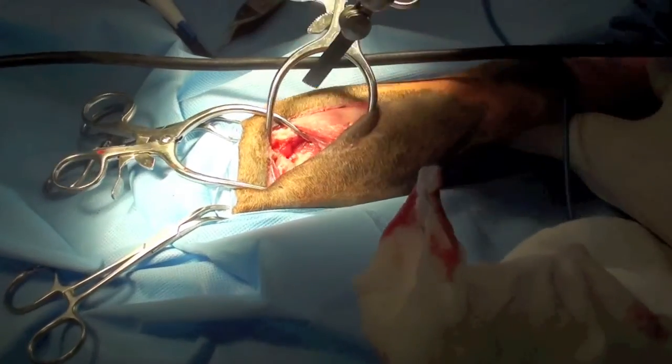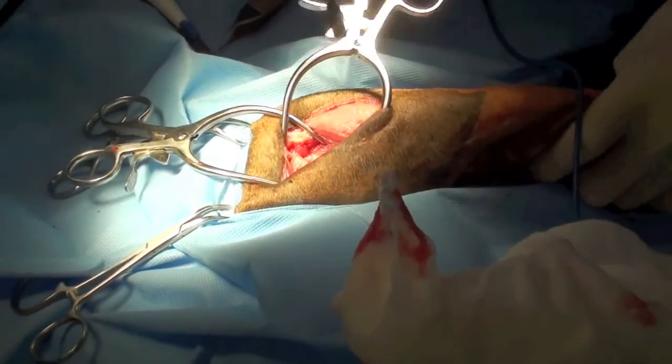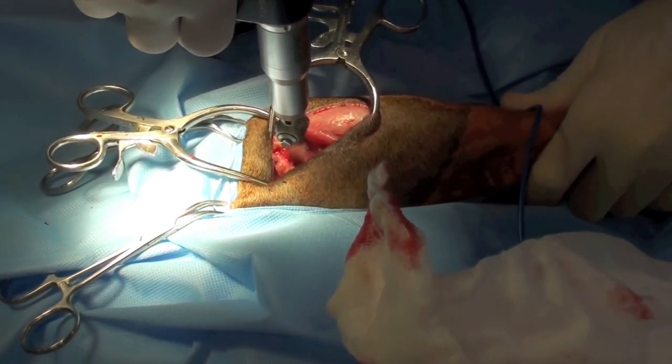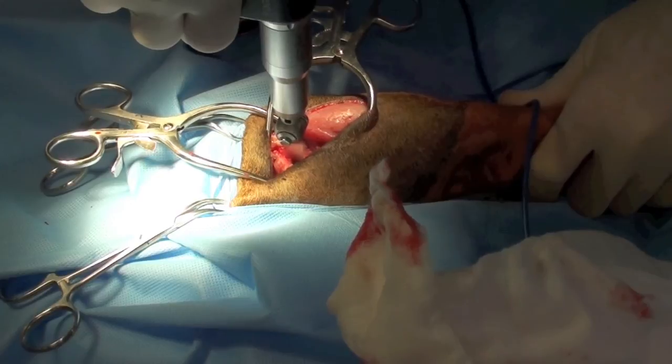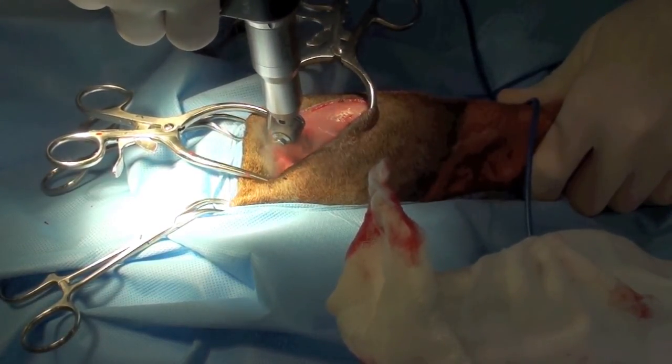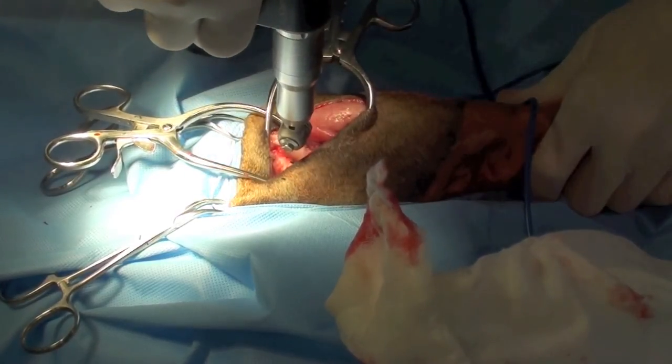An oscillating saw is used to make a cut in the femoral neck, taking care not to leave any of the articular cartilage behind. The stifle is pointed vertically in order to facilitate accessing the cranial surface of the femoral neck.